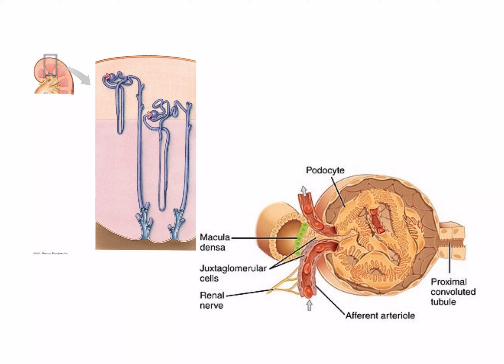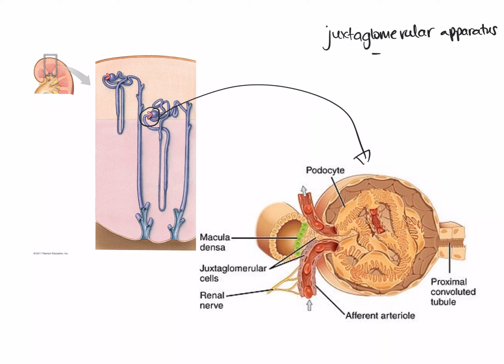And the feature that does this is collectively called the juxtaglomerular apparatus. It sounds like a big word, but it essentially is an apparatus or a mechanism that's near the glomerulus, or juxtaglomerular. Specifically, it's the macula densa cells that are really important for this because they are closely packed nuclei that sit within the epithelium of the distal convoluted tubule that we can see here highlighted in green.